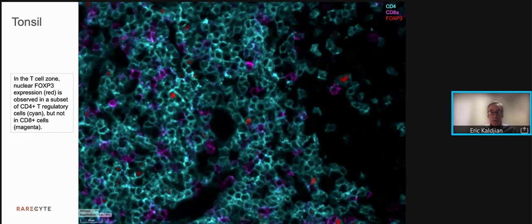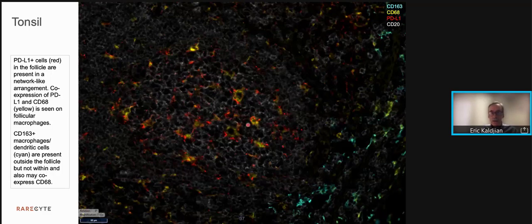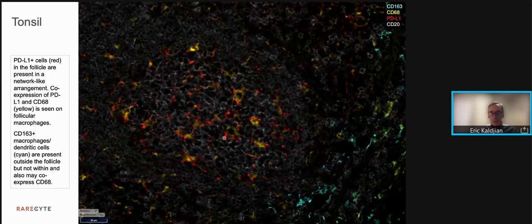As in the lymph node, FOXP3 is present in the nucleus of CD4 cells in cyan, but not in CD8 cells in magenta. When we look at the macrophage population within the context of the B cell follicle, again we see scattered macrophages — they seem to be increased in number, and the expression of PDL1 is much more prominent, forming a network-like arrangement within that follicle. Again, the CD163 marker of macrophages and dendritic cells is present on the outside of the follicle, and many of these cells co-express CD68, but it's not present within the follicle.